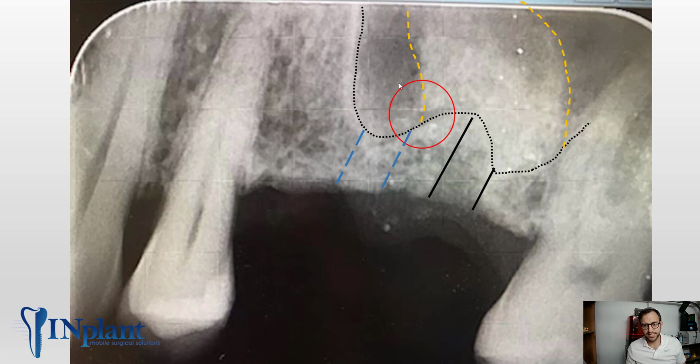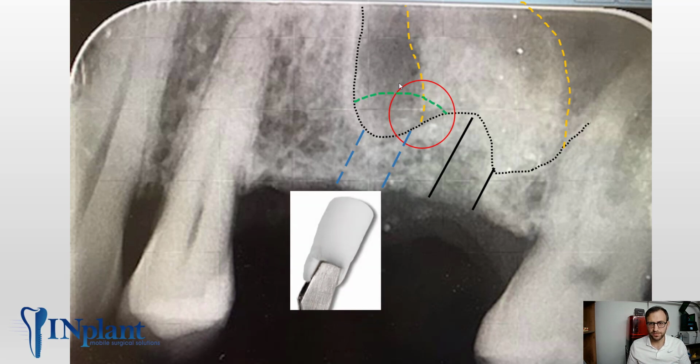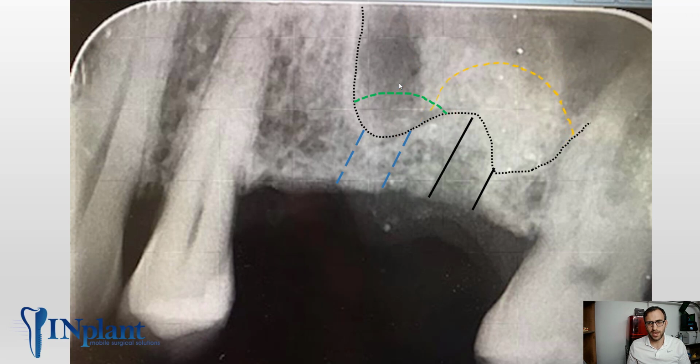So I think if we created a second opening in that most mesial area, and again, I'm going to start to do this in cases where I have that wavy floor, open a second opening, pack some collagen or PRF, and get another little lift. That small amount will allow our lift to happen a lot easier. So instead of having one dome, we'll have two. And again, those two domes won't intersect.